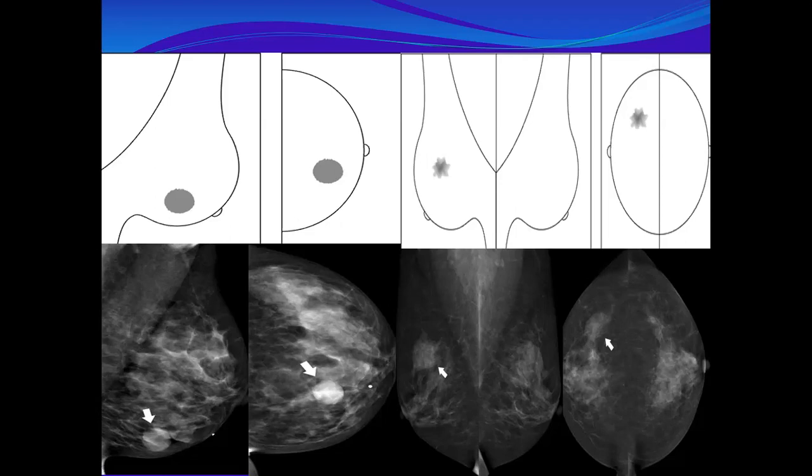Excuse me, Dr. Rabab. How could I differentiate whether it is a focal asymmetry or a mass if the mass has an irregular shape? If it has an irregular shape, some borders I think will be concave. Yes, you are right. We have seen that before. But if you are in doubt between a mass or an asymmetry, label it as focal asymmetry until it is proven to be a mass, until it fulfills the criteria of a mass. You got my point? Yes, I got it. Thank you.